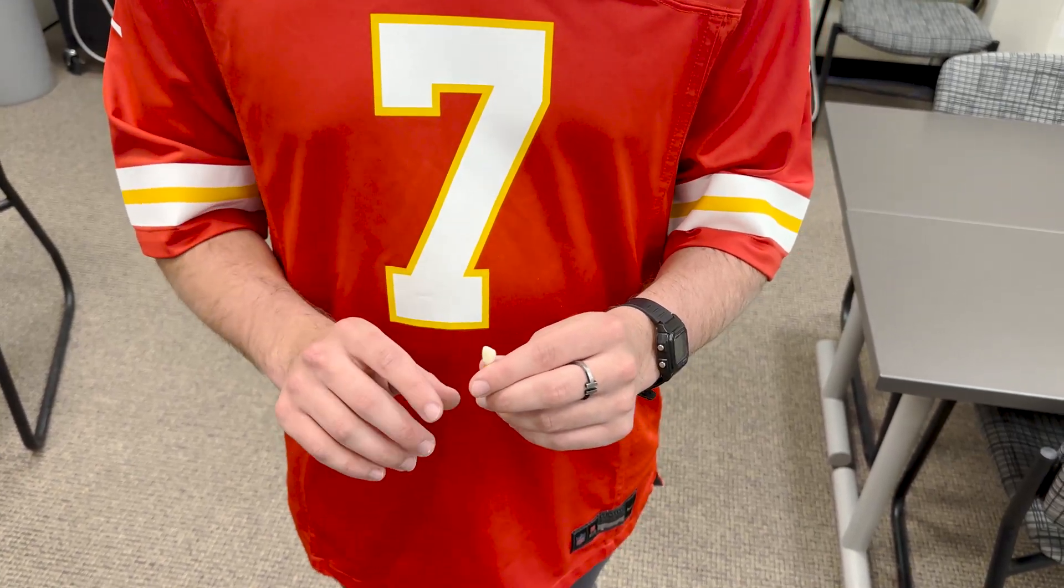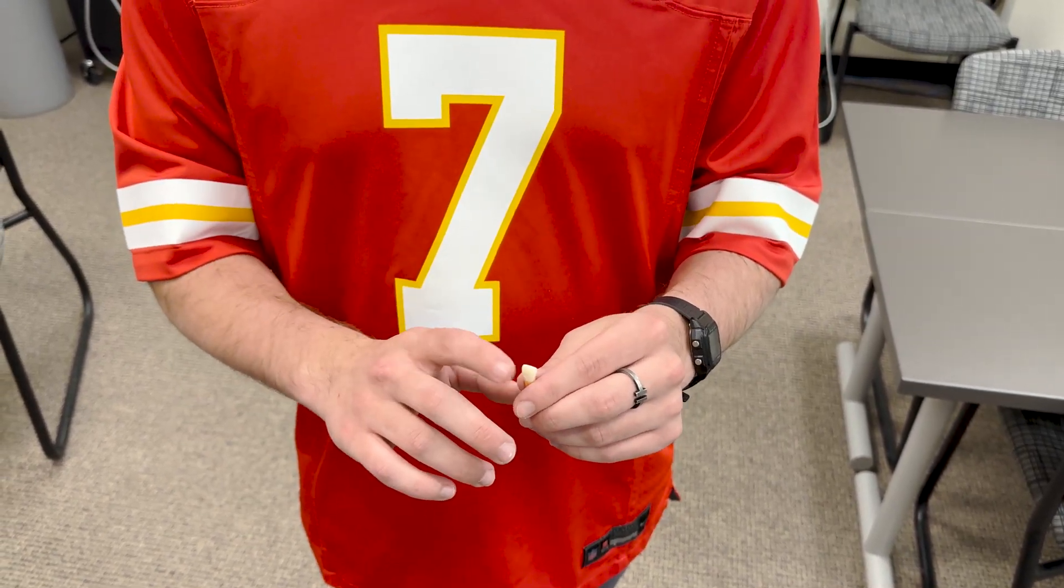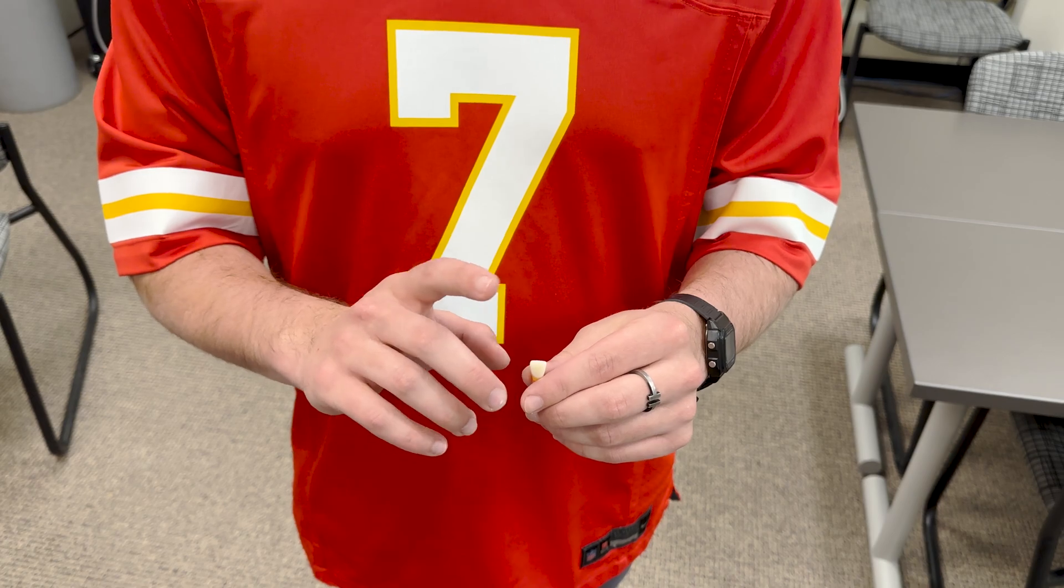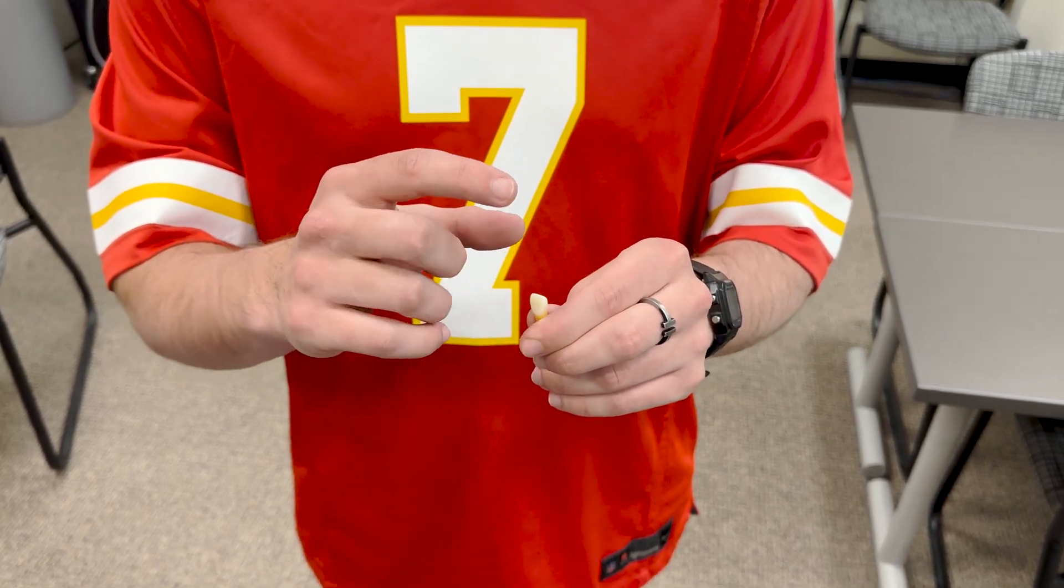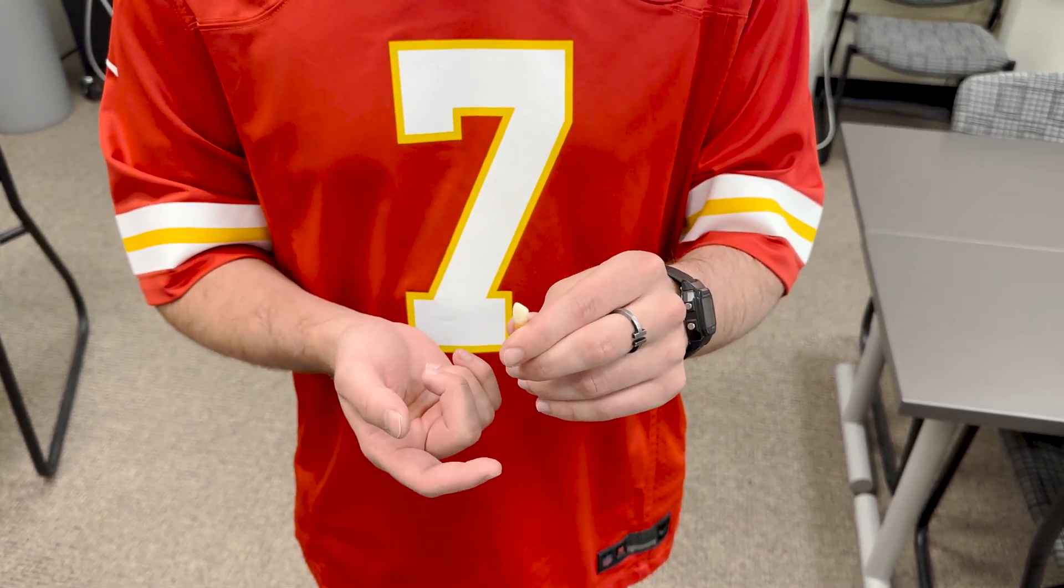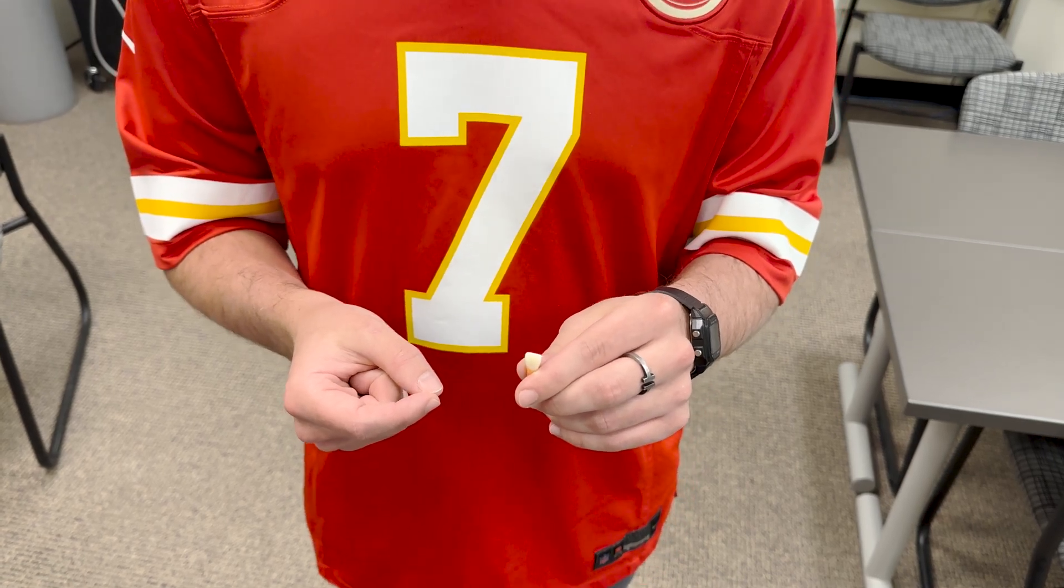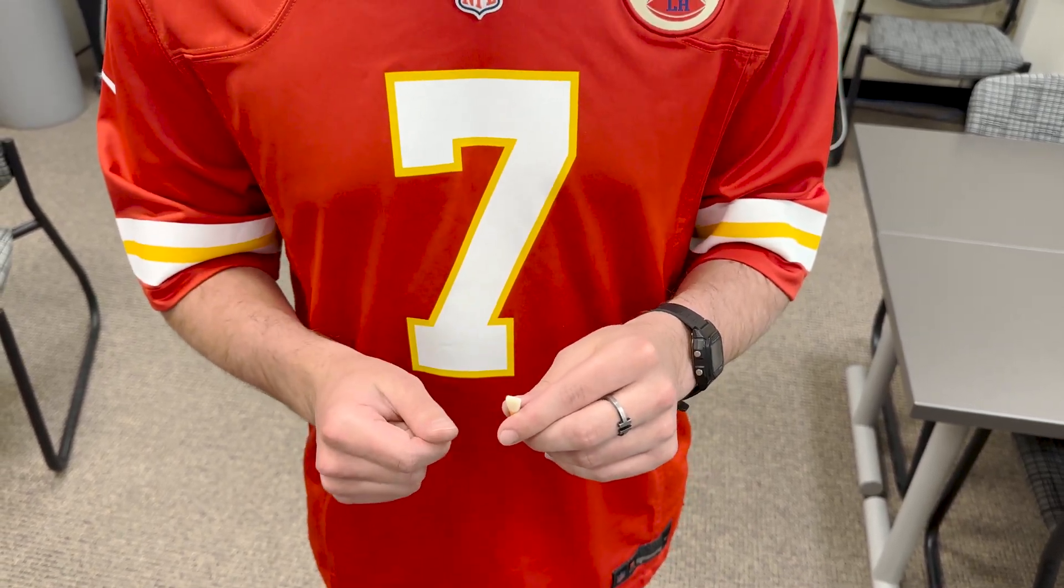The first thing you want to do before you mount your teeth is take your extracted teeth or plastic teeth and measure from the tip of the crown all the way to the apex. Make sure you write down that number because it'll come in handy when you're doing your root canals.